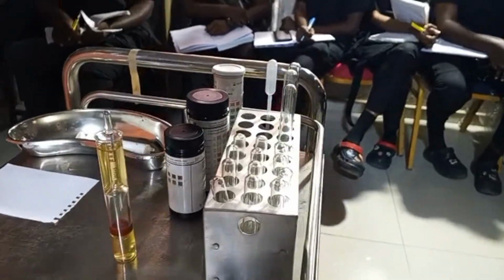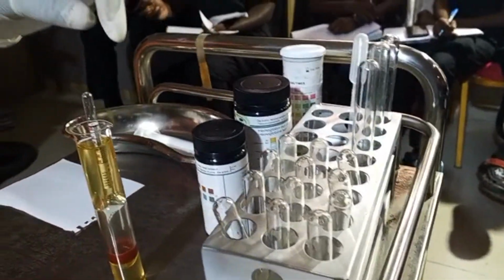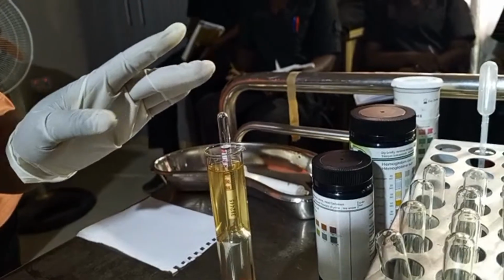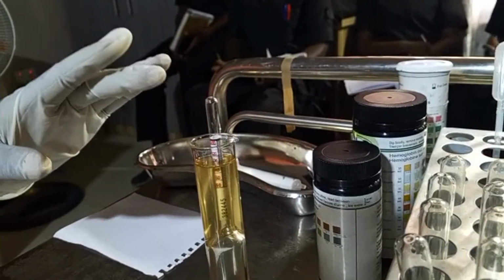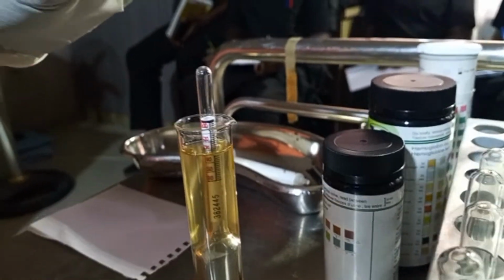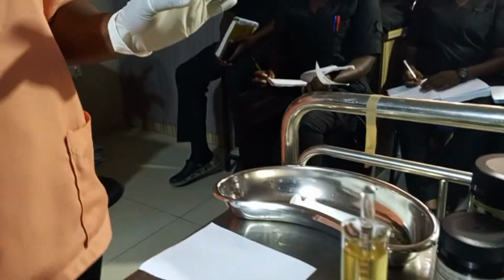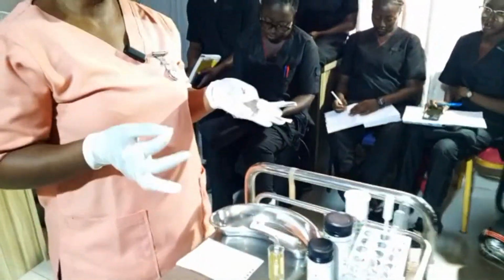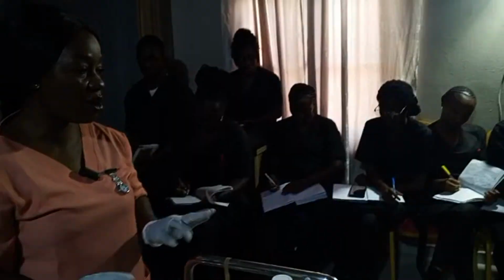And the specific gravity of this urine is 1.030. Then we note it, right? 1.030. And again, we note it.